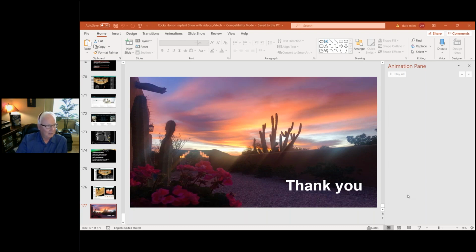That's a great question. I see lots of what, in radiology, we call osteopenic, and we mean that the trabecular pattern and the actual cancellous bone looks different. It looks like there's missing bone in the spinal column, which is the prime place we see it.